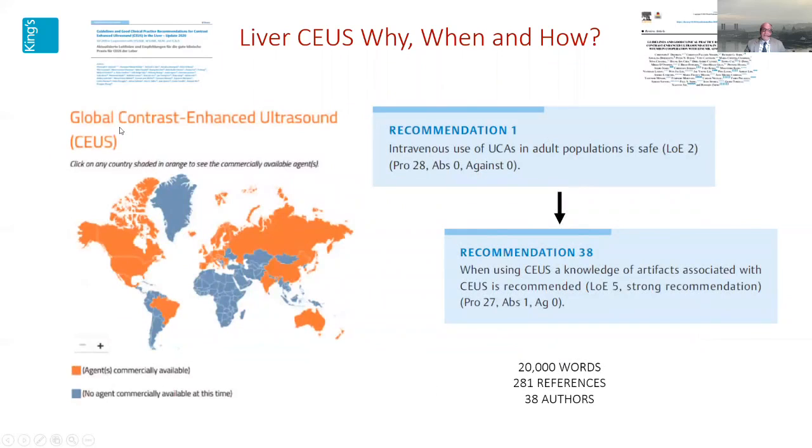Suffice to say, contrast-enhanced ultrasound is available in quite a large number of countries worldwide, though there are some particular areas where it's not yet licensed or used in any great detail. But this reflects also the infrastructure of the medical practice in these countries and the ability to support the use of contrast by the companies that are commercially responsible for these agents.